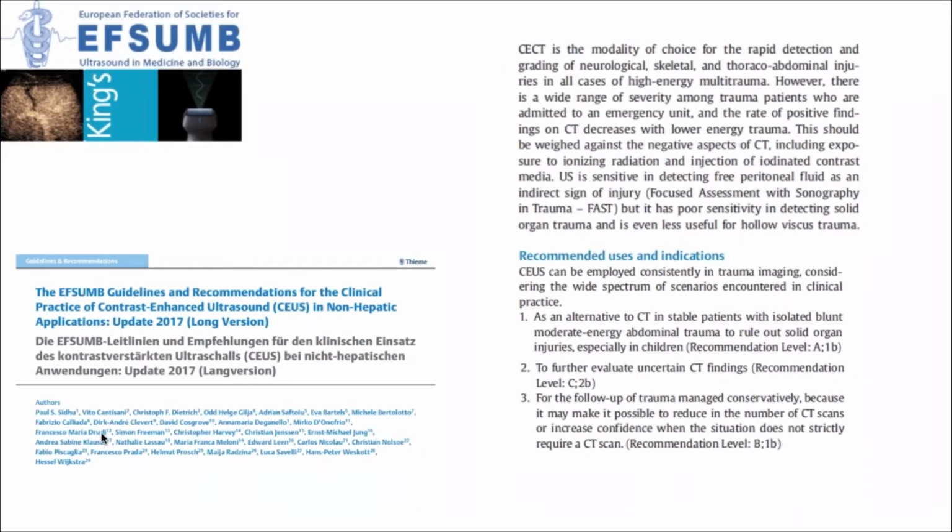Contrast-enhanced ultrasound over the last 20 to 25 years or so has come to the forefront. Although it's recognized very widely amongst many clinical teams for its uses, the one that everyone seems to think about is the hepatic use and characterization of liver lesions. But EFSUMB have brought out their guidelines and recently updated the non-hepatic guidelines. Really, rather than non-hepatic, it is the everything else guidelines, and that includes, in respect to trauma, hepatic injuries as well as every other organ injury.